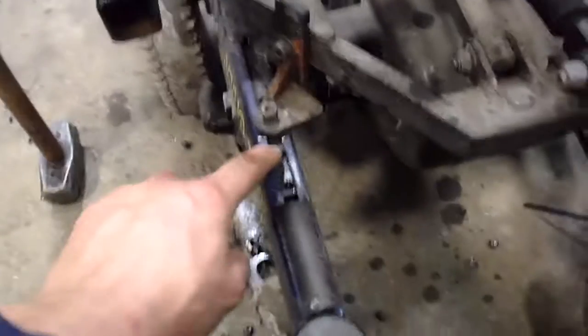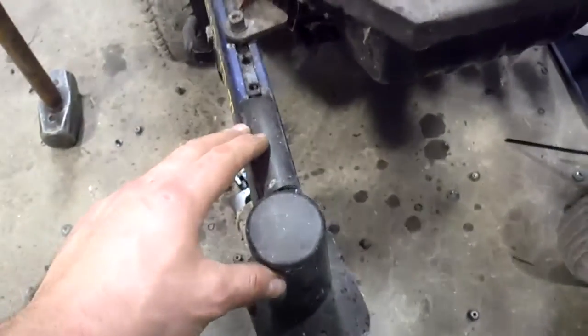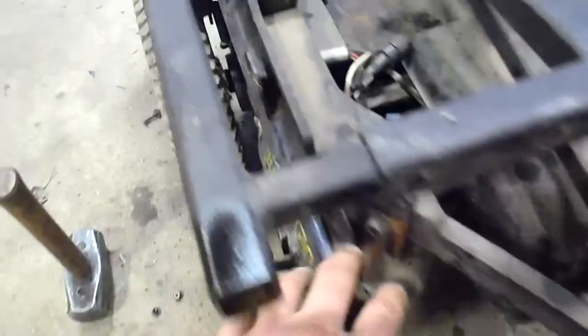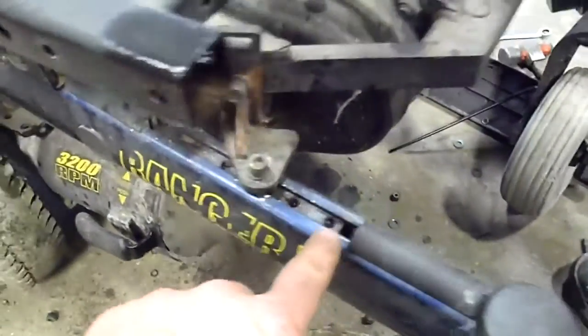So here, you can see adjustment for your whole seat frame to get closer to the front wheels. I think I'll probably do that just to get more clearance for the footrest. So I'm gonna have to figure out, yeah, the back is just right there. So it looks like it just slides in these rails, and then you just screw it into whatever hole you can line it up with. So I don't know, 1-inch increments or something there. You can see these slide in and out too. All of them, even that back bar. And I'm just gonna slide this frame.